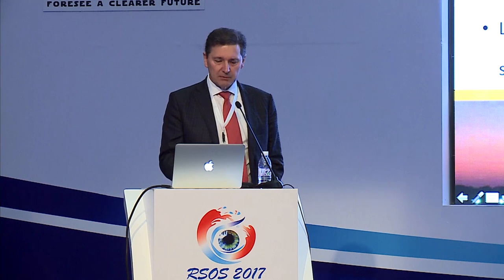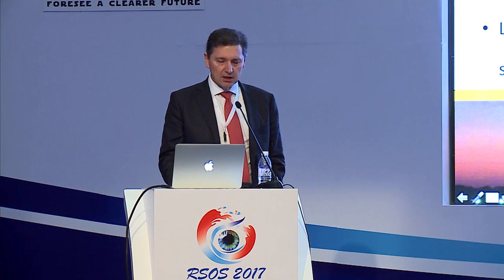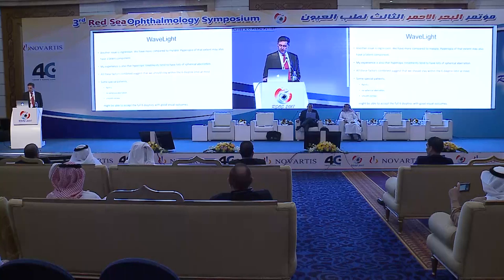So there's a lot of information. I want you to read just what the red line says. Wavelight is approved to treat hyperopia up to plus 6. And looking at a number of factors, all these factors combined suggest we should stay within the 6 diopter limit. So that's what we tend to do.